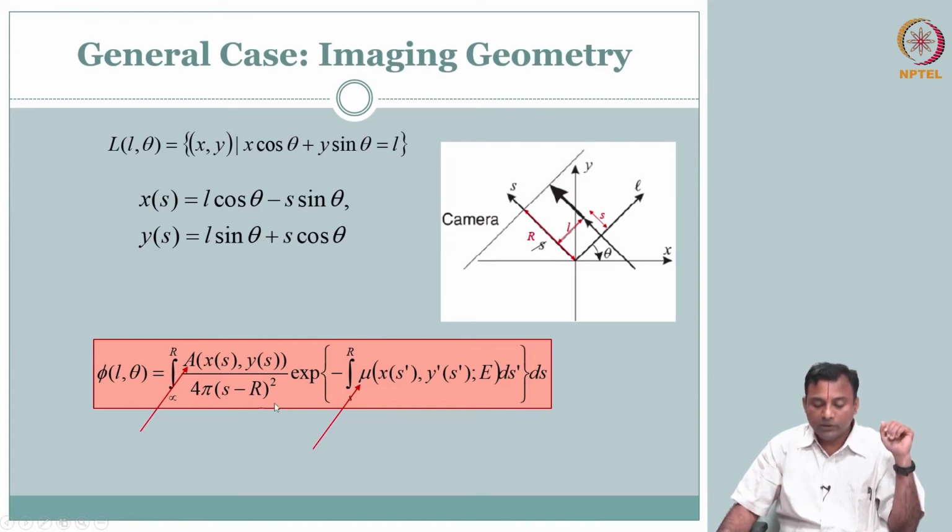Not only that, there is also this depth dependence. R is this direction, S is along the R. So, where it is located, there is an inverse square law that is affecting as well. So there are two problems here. One is mu, which is an unknown, and the other is some factor here which is dependent on depth and could contribute to the inverse square. I have a problem, I want this one. How do I simplify the problem? If I have additional information to simplify the problem, then perhaps it will become tractable.